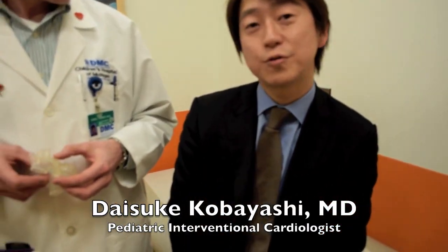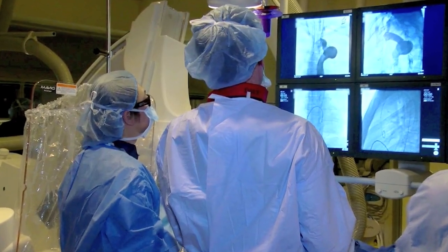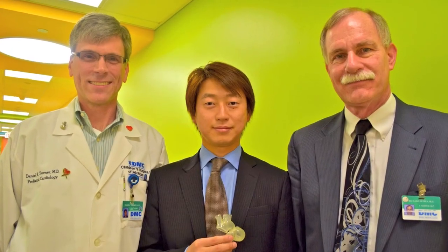I think it's very useful, especially for patients who have a very complex anatomy, like this aneurysm, and we think in the future we can utilize this modality for other patients as well.